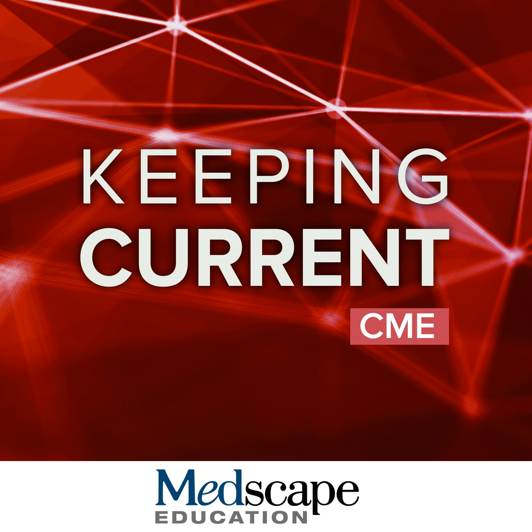So the first question is, what is meant by recent brain MRI prior to treatment? The FDA labels specify that a recent brain MRI is needed prior to treatment to evaluate for those exclusionary findings. In appropriate use recommendations, that is clarified as within 1 year prior to the initiation of therapy. And in many cases, people have thought closer to 3 to 6 months prior to therapy, ideally.